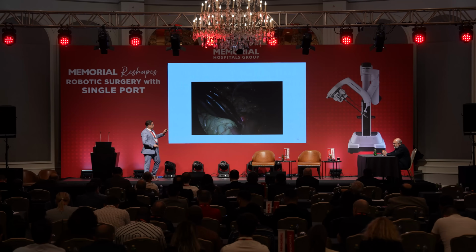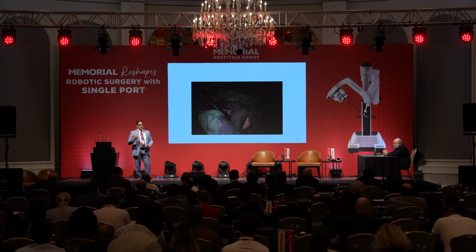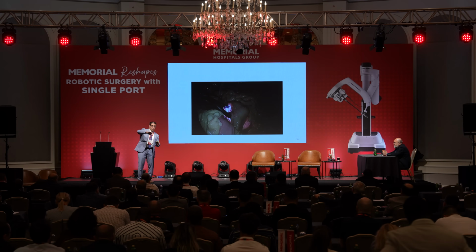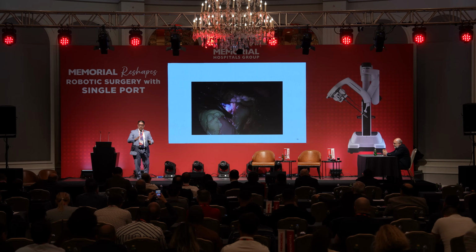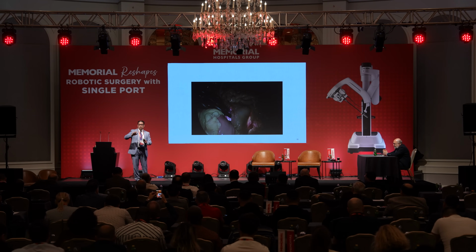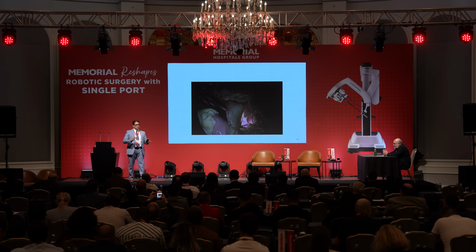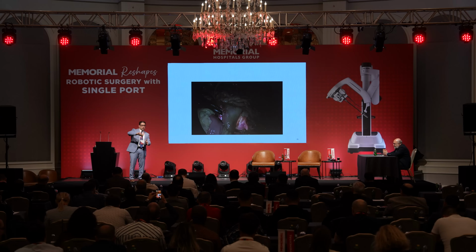Another thing I wasn't able to produce here, that the professor who spoke in the gynecology session, he's very good. When he spoke about how you can do the horizon and you can switch the horizon, the more you do from those, you will learn that you can actually look on the side. But the view is going to be altered for you. So you don't do this in the beginning. In the beginning, stick with basics, stick with the fundamentals of anatomy, and then when you get more comfortable, you start doing the 45 degrees horizon shifts, okay?